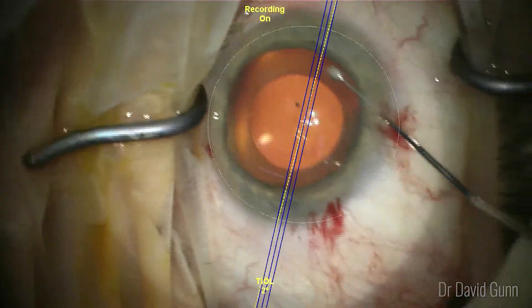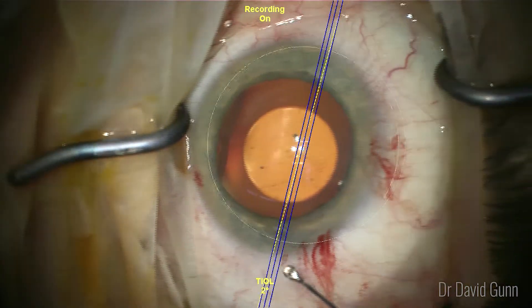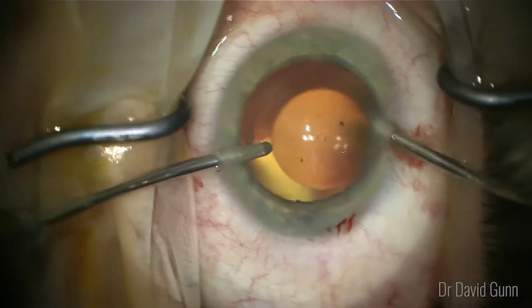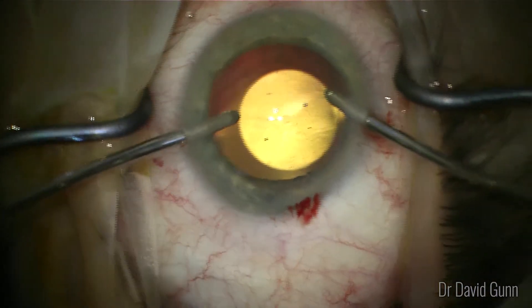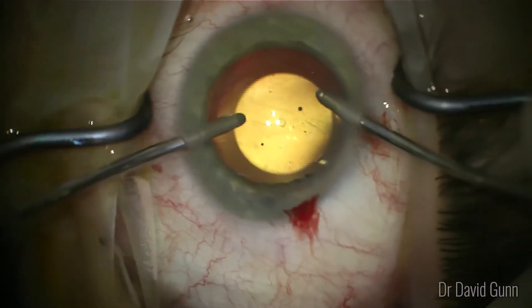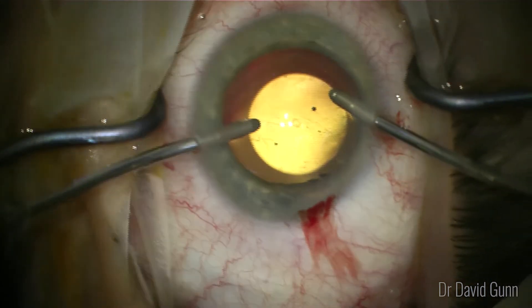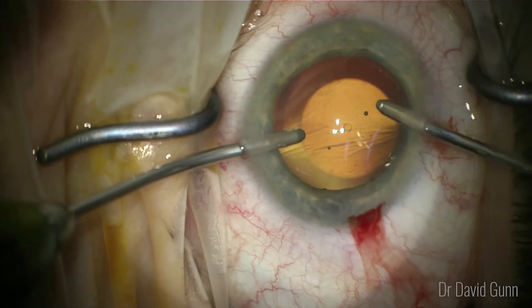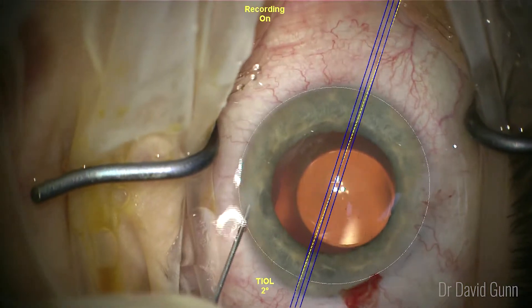At this point I'm performing toric alignment. One of the most important steps of this surgery is to remove the viscoelastic very thoroughly, as retained viscoelastic can cause raised intraocular pressure, particularly at the two to four hour post-op mark. Every patient should be seen two hours following surgery to check the pressure hasn't risen.